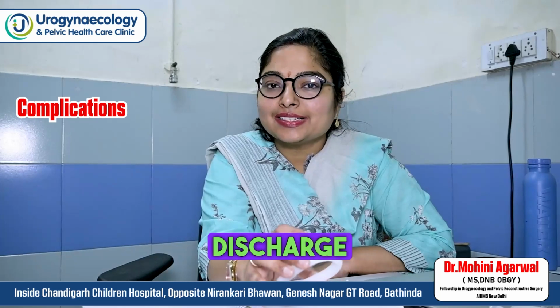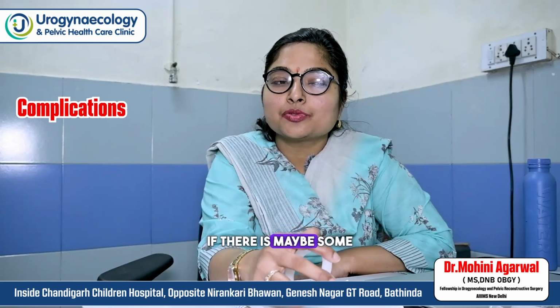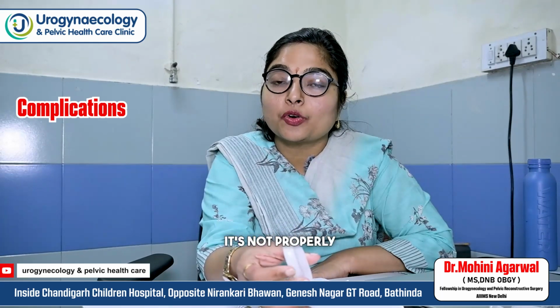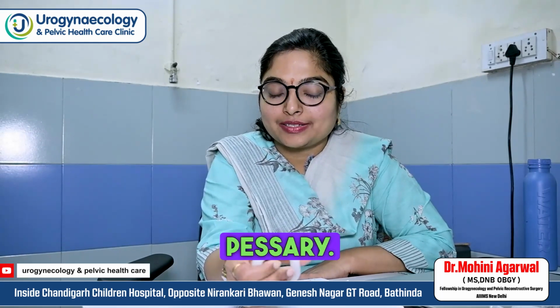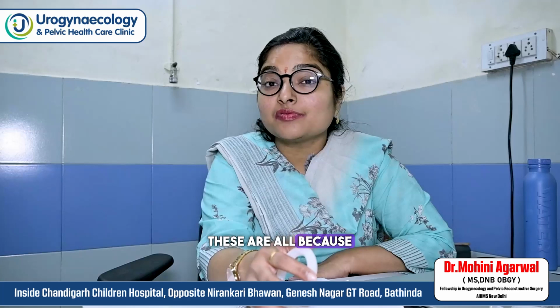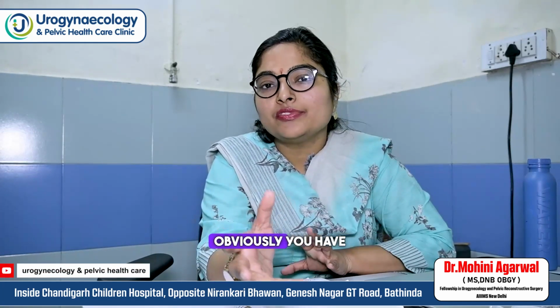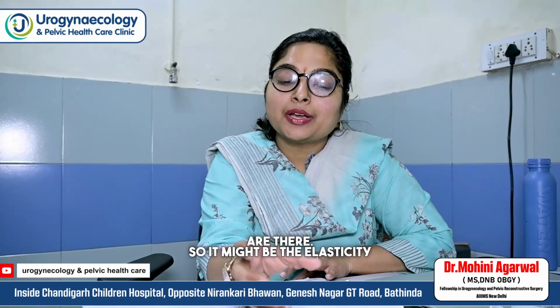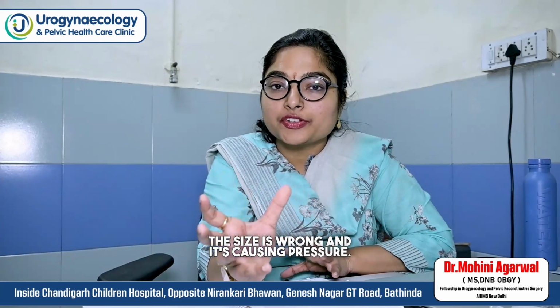So usually discharge settles. Foul smelling discharge, if there is some obstruction or an atrophic vagina, only then does it lead to foul smelling if the pessary is not properly self-cared for. So that's why caring for the pessary is important. Then what other complications? Bleeding and pressure sores are because of improper size of the pessary, and for a complication like a fistula, obviously you have to operate. Size, obstruction or pressure sores: it might be that the elasticity has been lost, it has not been properly cared for, or the size is wrong and it is causing pressure, so you remove it.